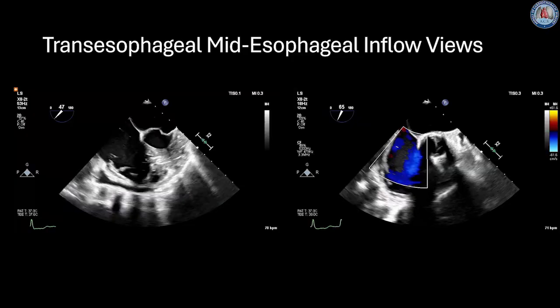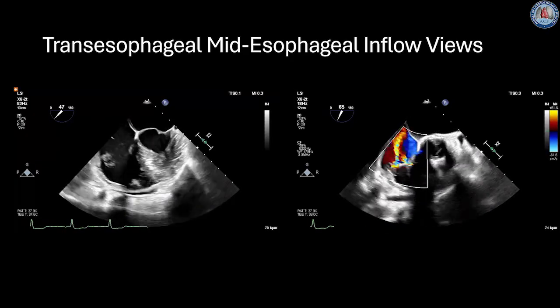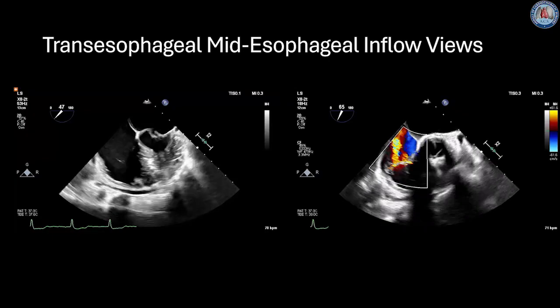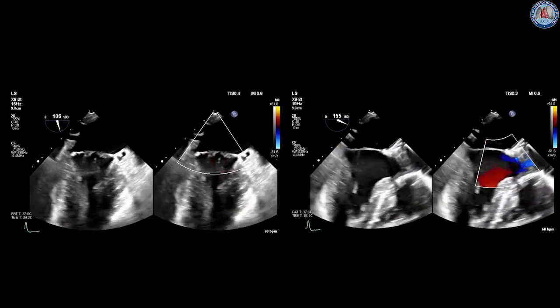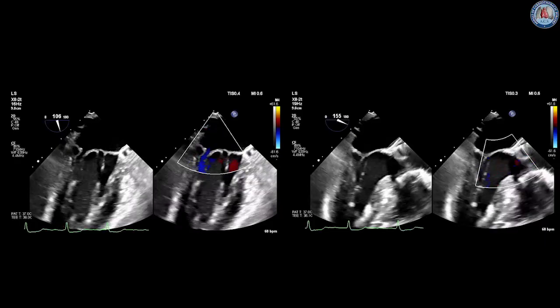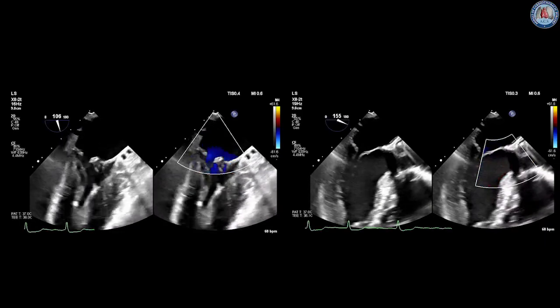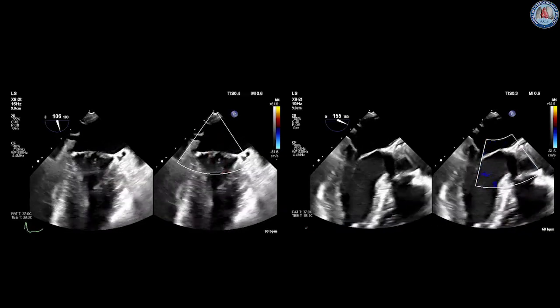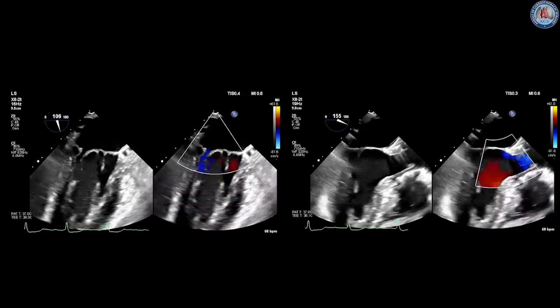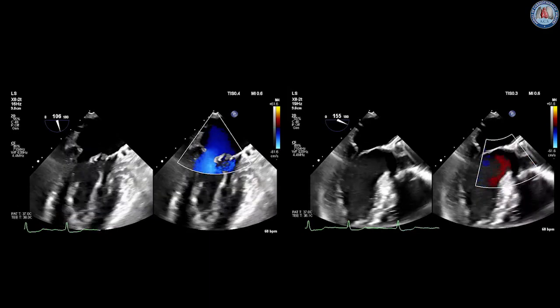Overall, RV systolic function was normal, and the etiology of the TR jet was thought to be secondary to a myxomatous valve and right heart chamber enlargement. A systematic sweep of the remaining valves demonstrated a normal mitral valve with only trace regurgitation and a well-functioning transcatheter aortic valve prosthesis with no valvular regurgitation, or PVL.